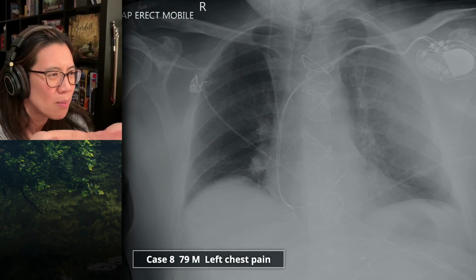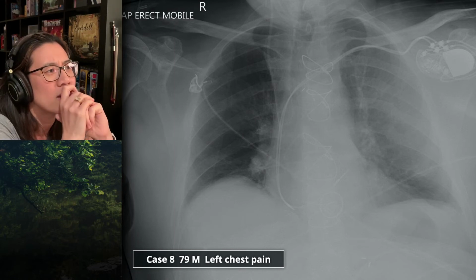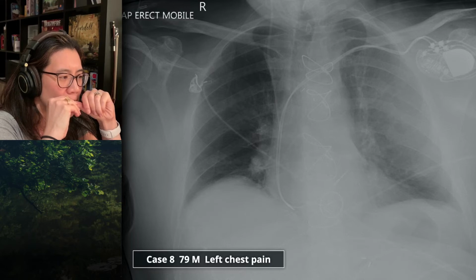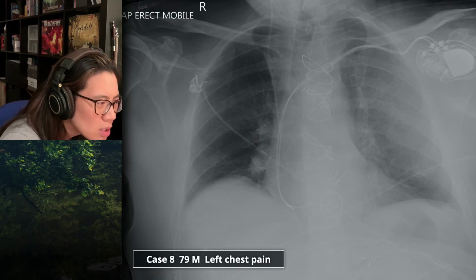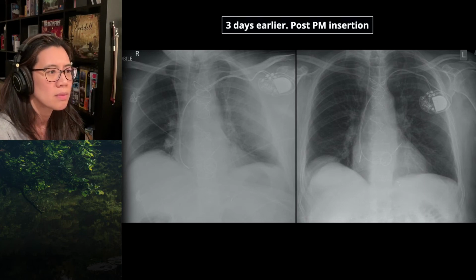So that pacemaker's been put in at a funny angle. In a funny angle, yeah. But where are the tips of the leads? Which tip? The intracardiac tips? Yep. Oh, now you're testing me. One's in the right atrium, and the other one is probably in the coronary sinus. No, it's probably in the right ventricle. It's probably all right. Okay. So let's assume the right ventricular one's all right, but where's the tip of the atrial lead? Oh, it's quite low. Very low. Yeah. Now go to the next slide and you'll see what it looked like when they first put it in.